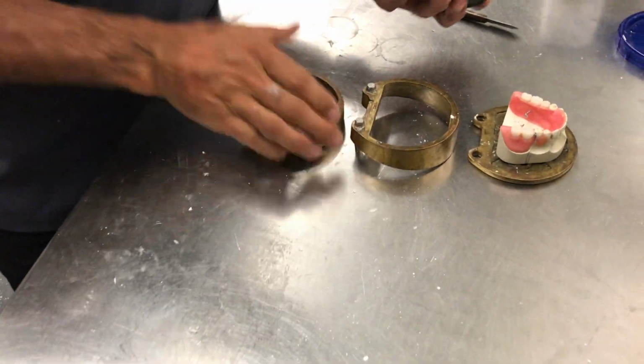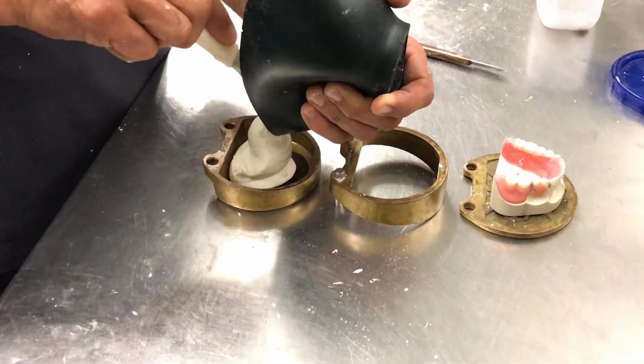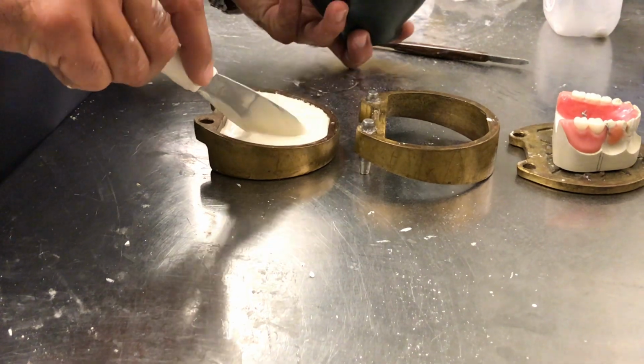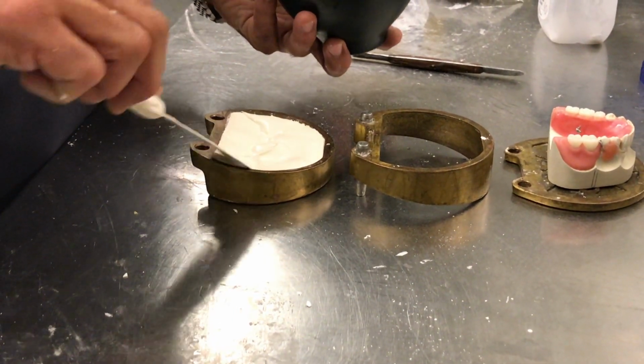Certainly we can move these out of the way, we don't need them. Thank you to my cameraman. Dispense some stone on the lower half. Vibrate it all the way to the bottom. Maybe a little bit too much, I can take some out. All the way to the edges.